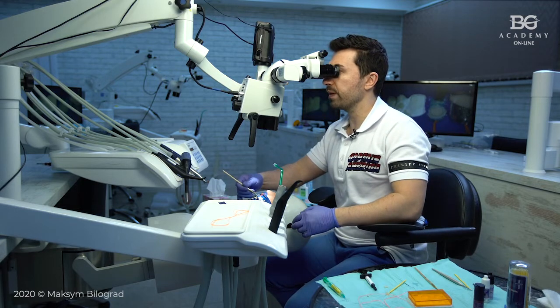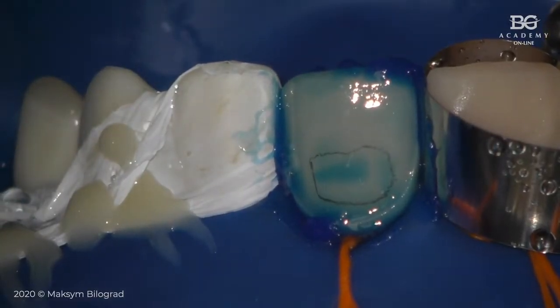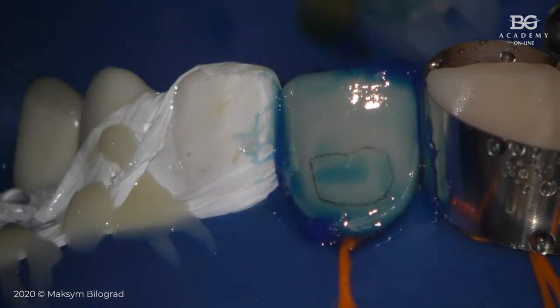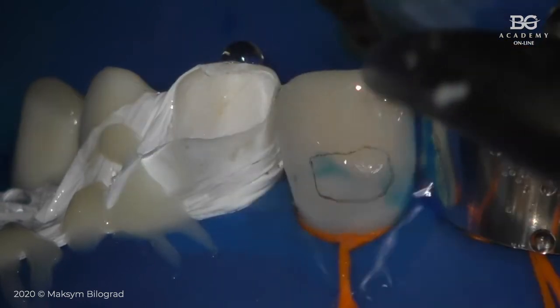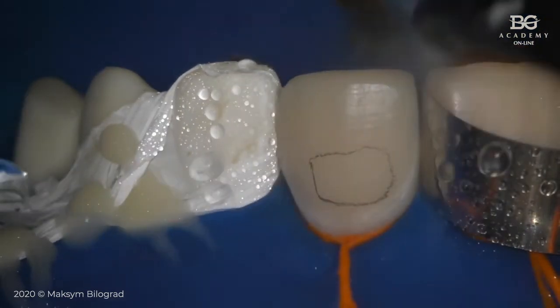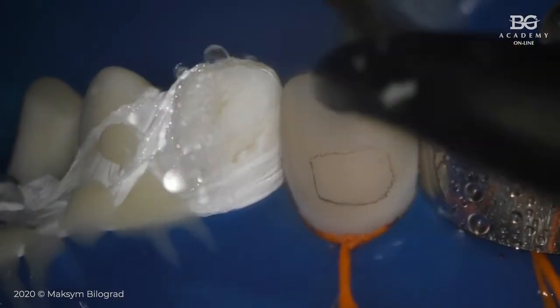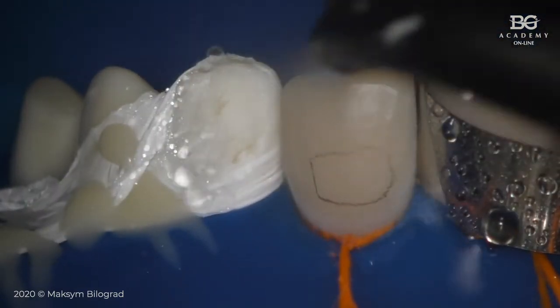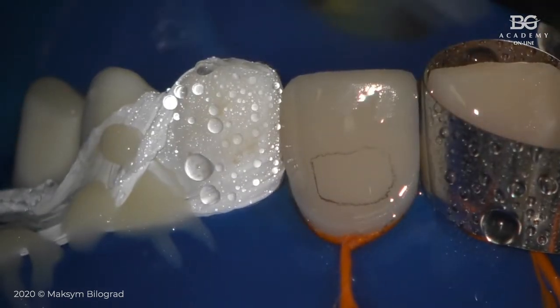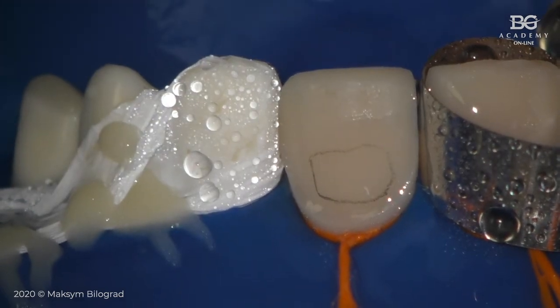Then look at what I will do. I will take my brush and I will spread etching gel to the surface of dentin. Then I count for 5 and then we rinse and dry. Okay, so let's pretend that we did it.